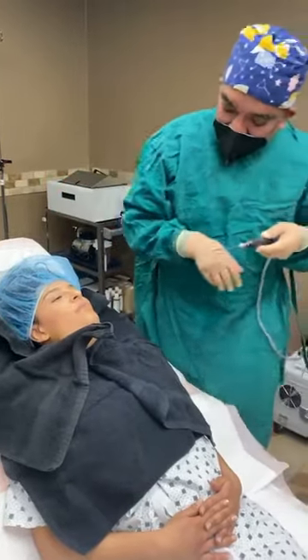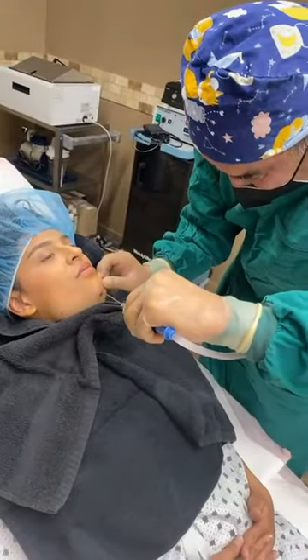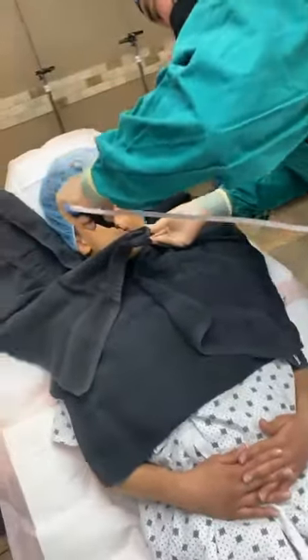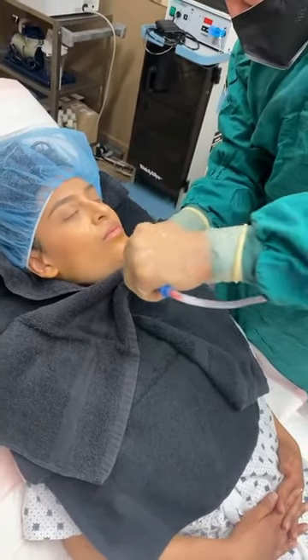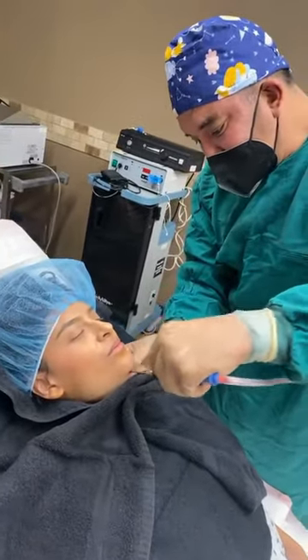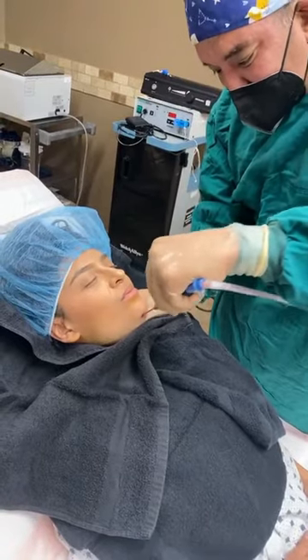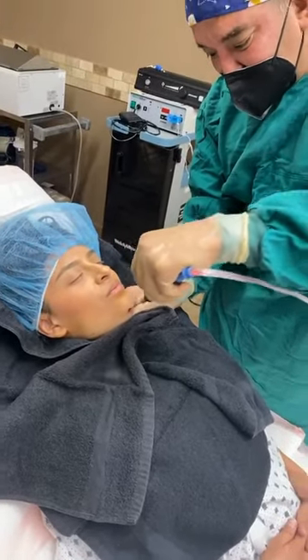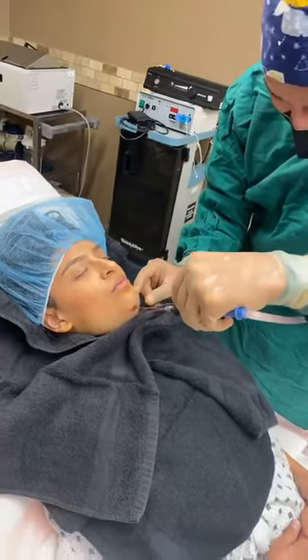That's more than we need. Okay, so next, we're going to go to the other side. Now, I do use Kybella, which is a fat-reducing solution. However, I found the chin liposuction is superior to Kybella. But if you're not comfortable with syringes and needles and you're just nervous, Kybella can work, but it can burn and swell up for a number of weeks, so most people will not want to do that.